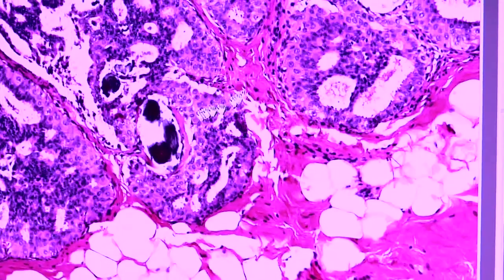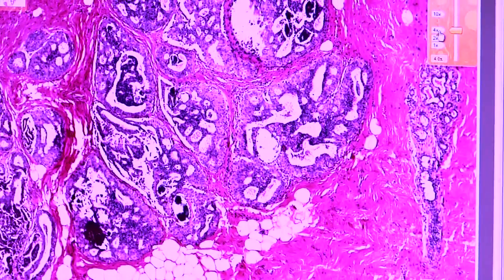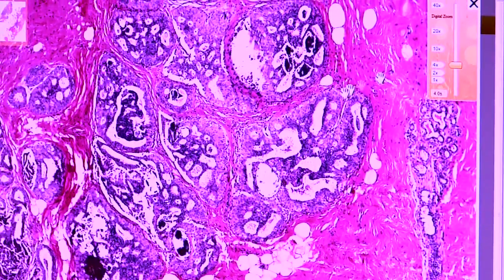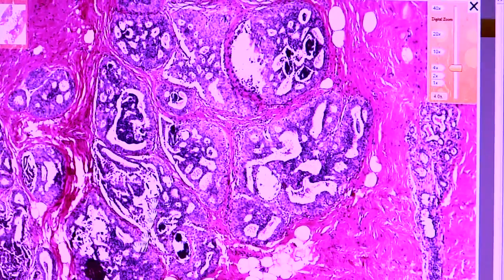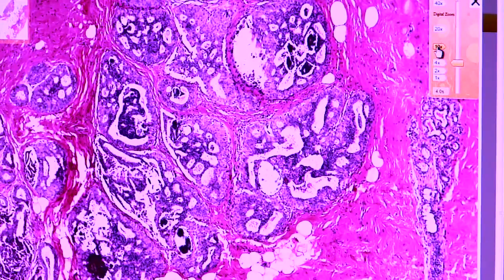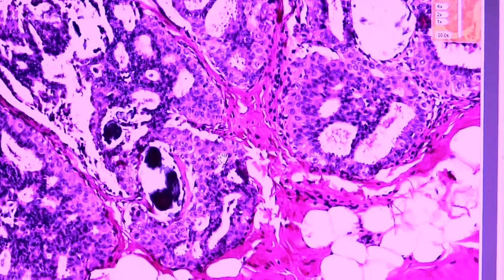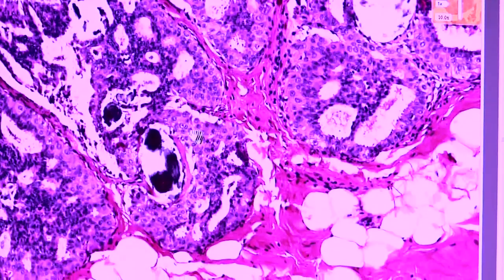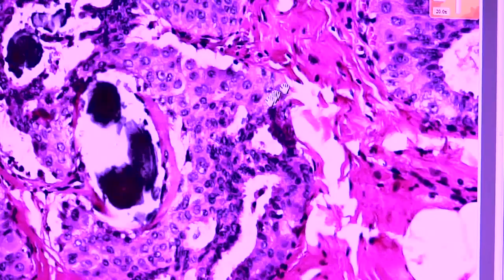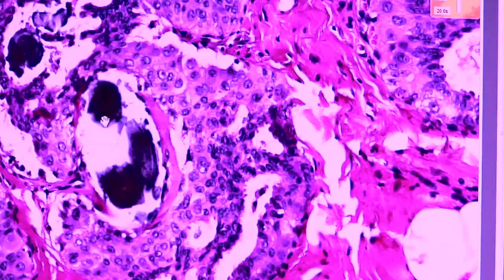More importantly, if we again go back to 4X, we're shuttling between magnifications as pathologists do with the microscope. The virtual microscopy allows us to do the same thing with greater efficiency. We see that the microcalcifications are accompanied by an intraductal proliferative process. We see that this intraductal proliferative process consists of a monotonous proliferation of cells, which are very pink in appearance. We could look even closer at 20X. We see these cells, they're very monotonous. They are filling the duct. Inside the lumen of the duct is this microcalcification.